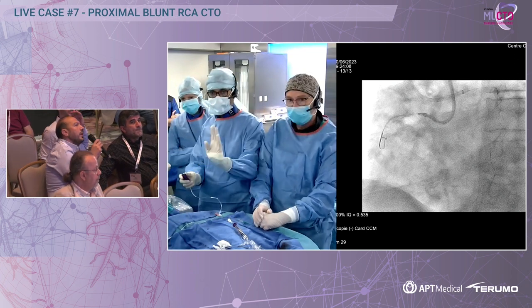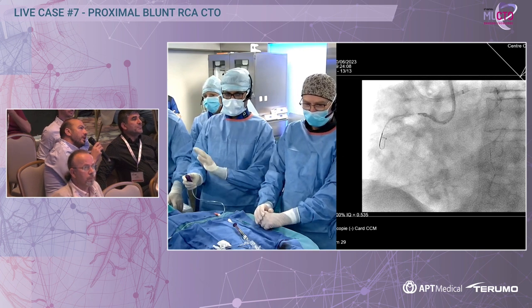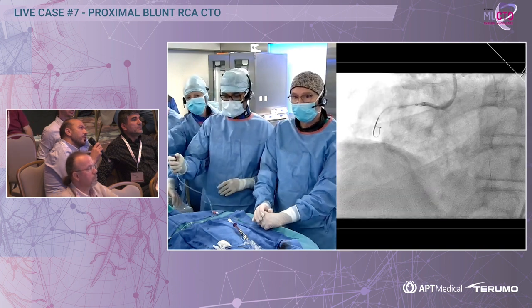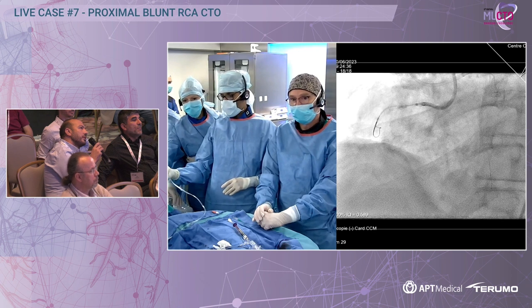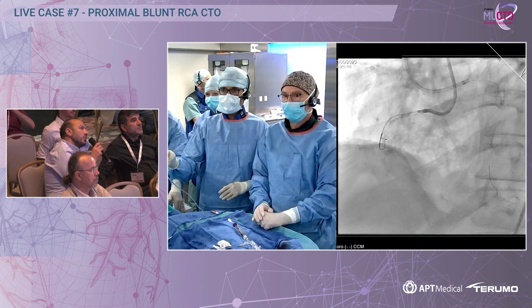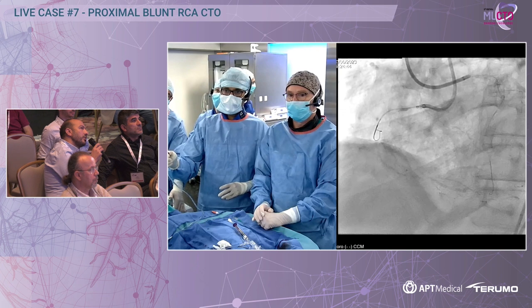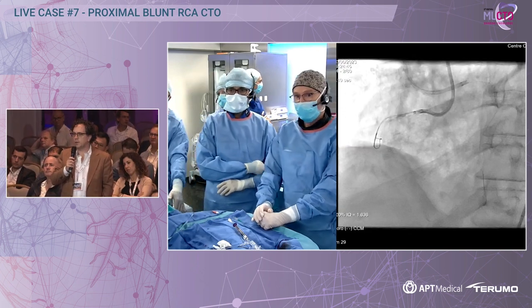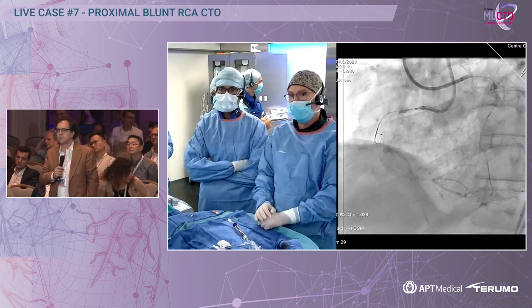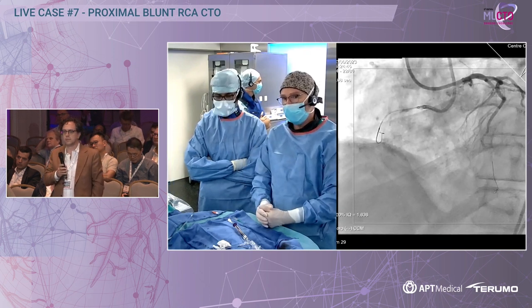Hi Alex, hi Arun, it's Yasser Sadok. Now you've done some antegrade knuckling — this is, I think, the perfect time to start retrogradely and solve the issue of vessel architecture from the antegrade side. I think you have to start retrograde now. Well, yes, but that's why we took a retrograde show — to be sure we are just in front of the distal cap and not past it.